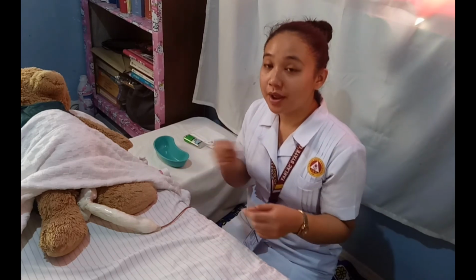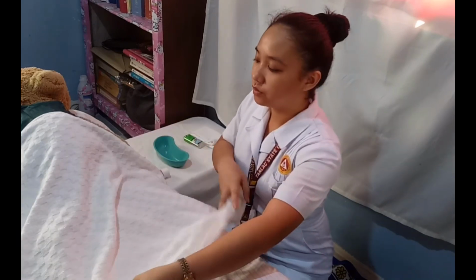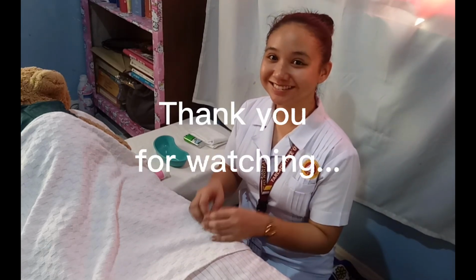Then you need to record all the findings that you get and all the things that you do. But before that, you need to make your patient comfortable. So here you go. So, sir, are you comfortable? Then, like what I've said, you need to record all the things that you did, and also the reaction of your patient, the time of the catheterization, and also the amount of the urine. So that's it.